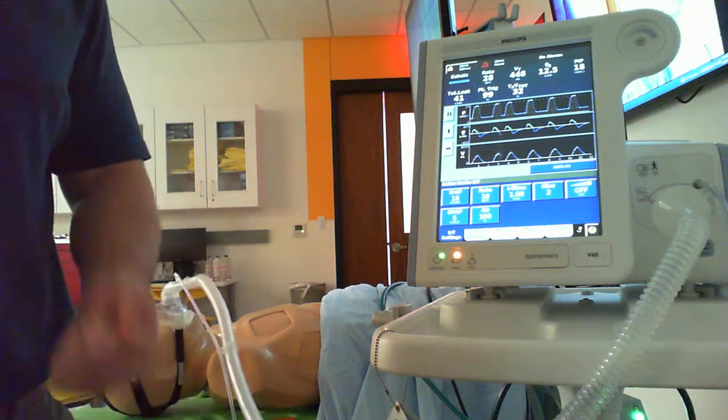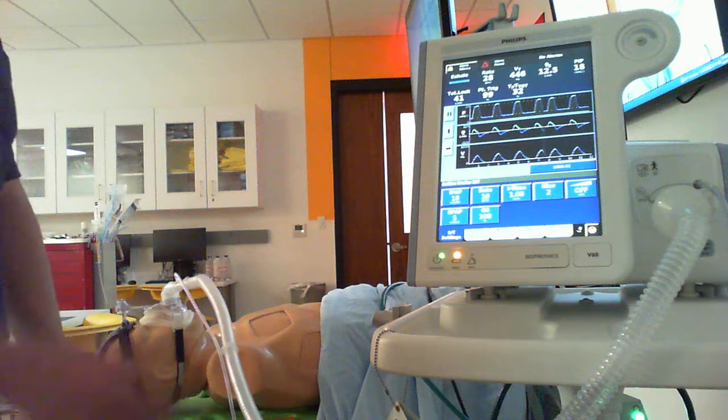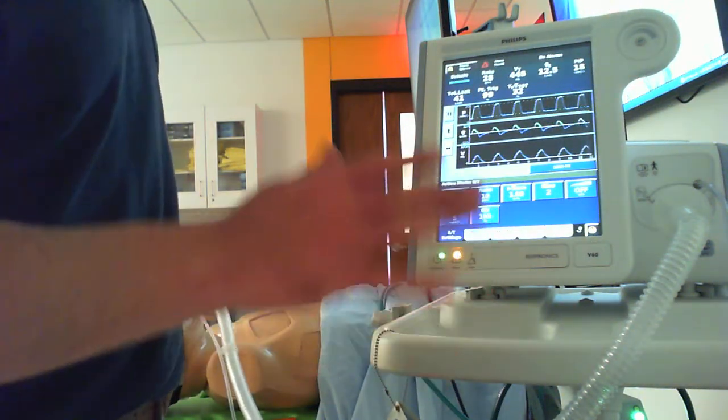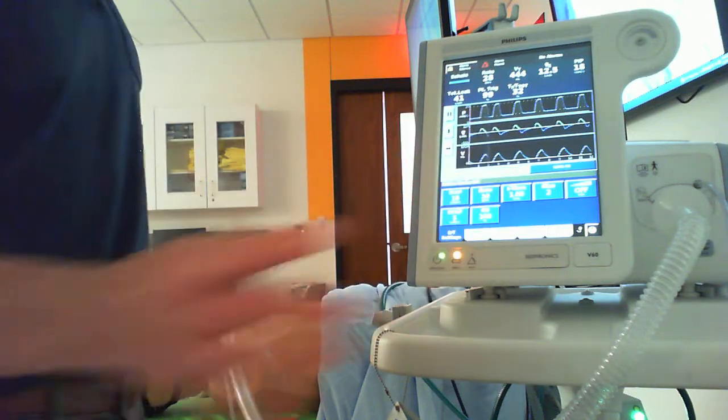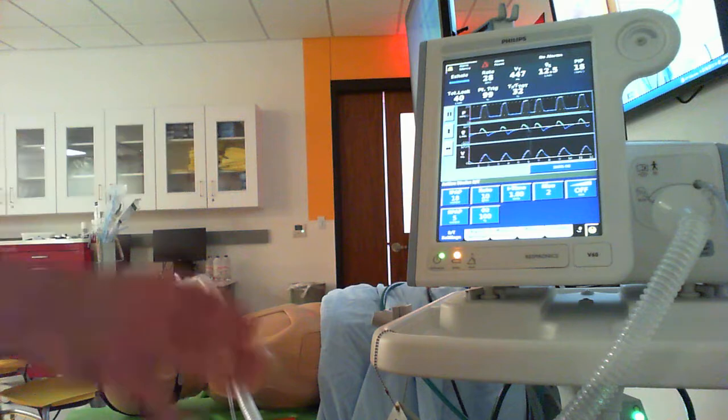The machine can't sense it. Do they have auto PEEP and they're not triggering? Is their rate set too high? What's going on there? And then TI total, we'll talk about that a little bit more as we get into invasive ventilation, but that's just a different way of kind of looking at I to E ratio, and some people use that, some people do not.